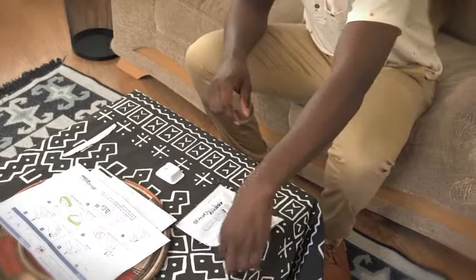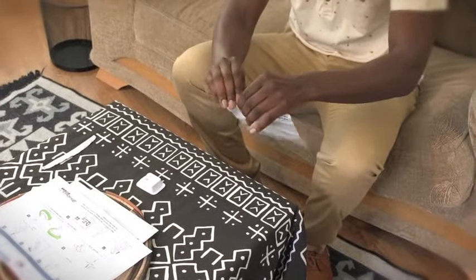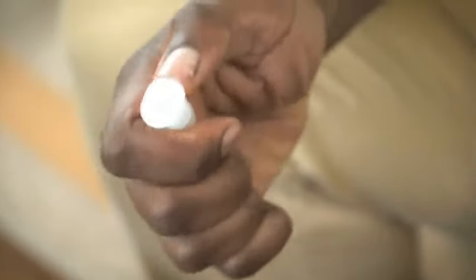Find the test tube and remove it by opening the pack. Next, remove the cap and place the tube in the tube holder.